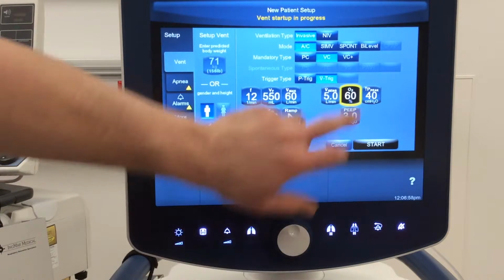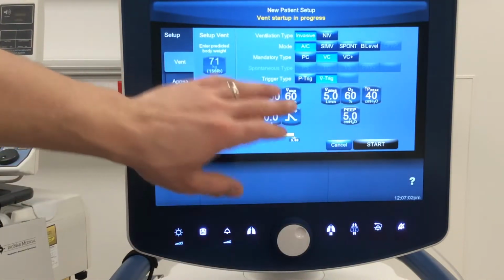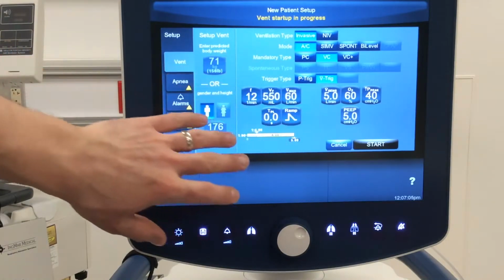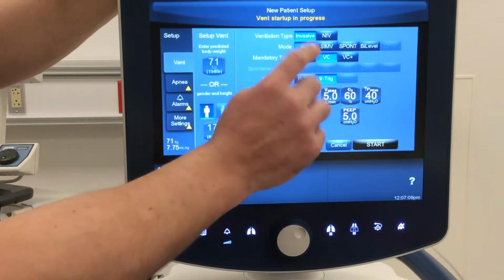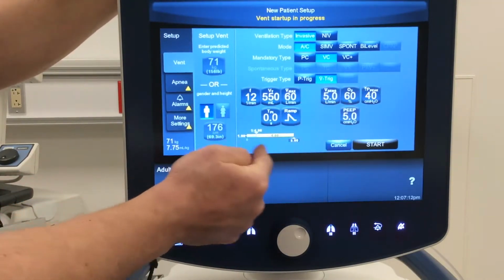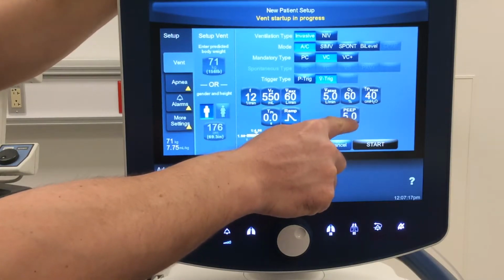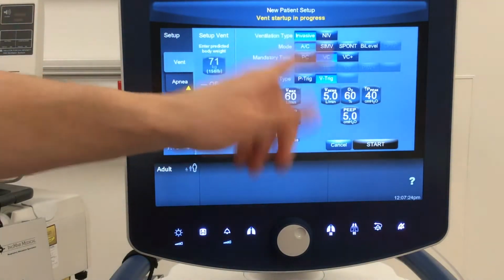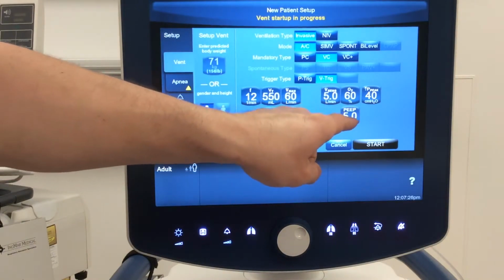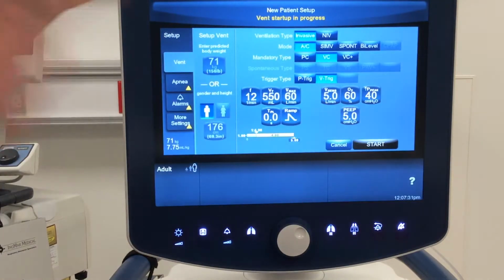And let's talk a little bit more. Okay, so we said that the patient is going to trigger a breath and the same result occurs, and that's a hallmark thing of assist control ventilation. Whenever the patient exhales, so that breath is cycled off after that 1 second, they've delivered that 550 mils, they're going to go back down to our baseline of PEEP of 5. The pressure in their lungs is going to be great because of the work that we've done to push that breath in. Okay, the elastic recoil of the lungs should make them quickly, hopefully, exhale down to that baseline pressure of 5. And then the timer resets and we're just waiting.